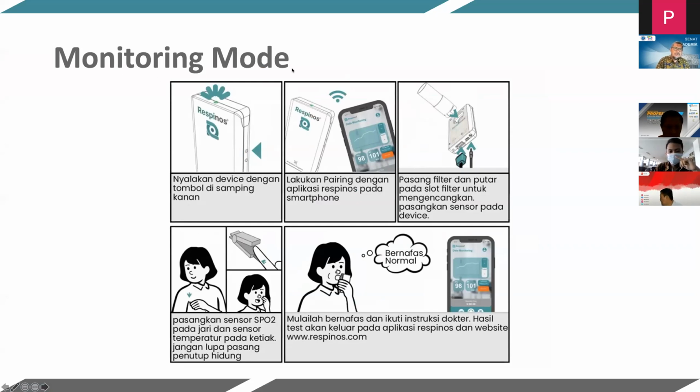When we're using monitoring mode, we can turn on the device, do pairing, and connect with the sensors, the SpO2 and the temperature sensors, and also the mouthpiece.